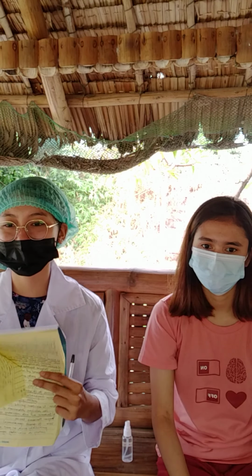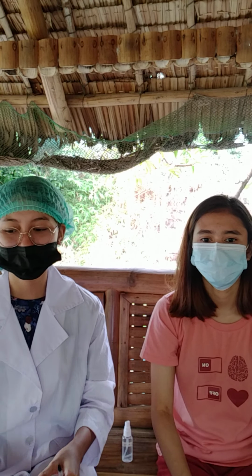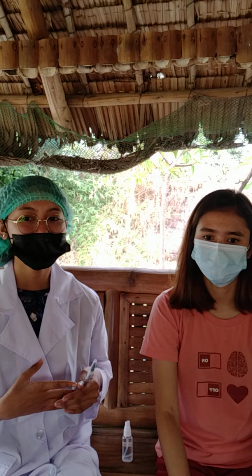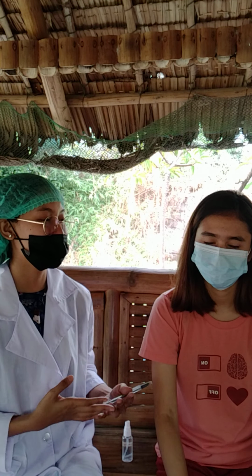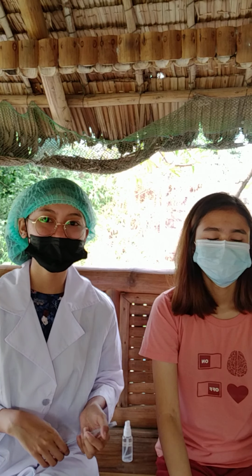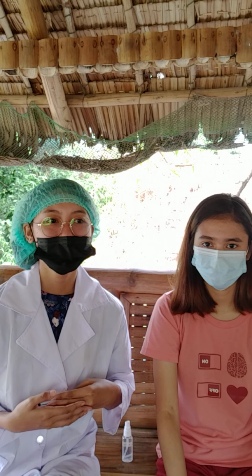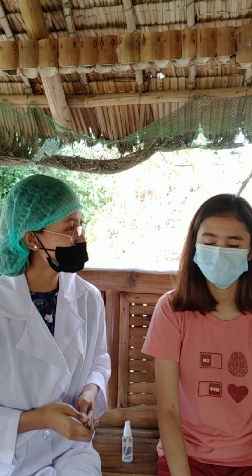And then after that is report abnormal findings to the appropriate person, and then identify the arm and site of the assessment if other than the brachial. So this is the end of the assessing of brachial blood pressure. Thank you po, ma'am.